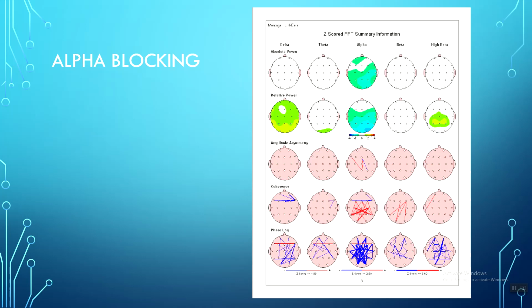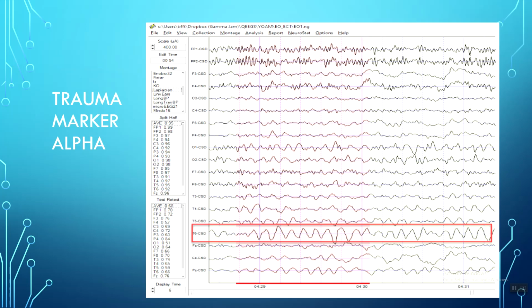This is a little girl with nightmares, right? She closes her eyes. She does not relax. She white knuckles it. She does not let go, right? There's a stress. This is a pattern of stress. This is one sign of a trauma. But it doesn't necessarily have to be a trauma. It just means that they're having a very hard time relaxing.